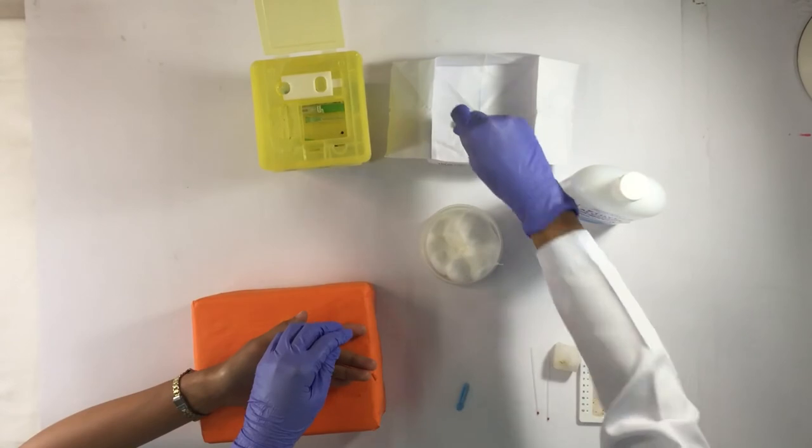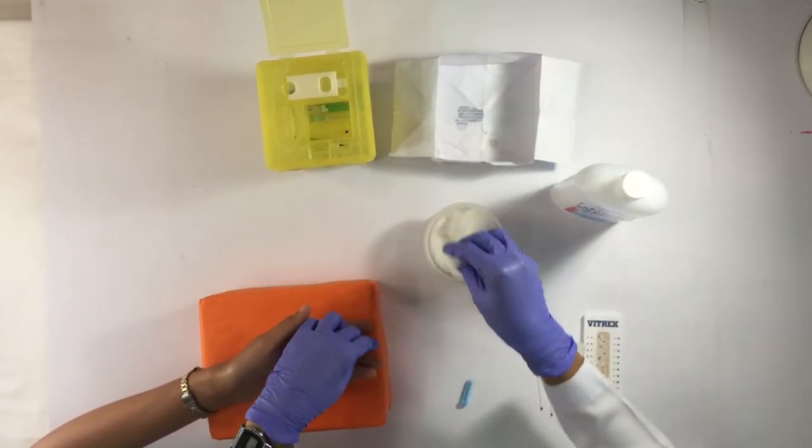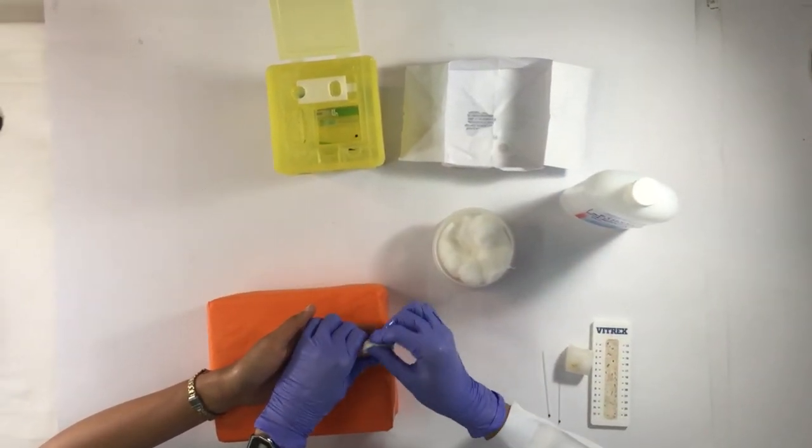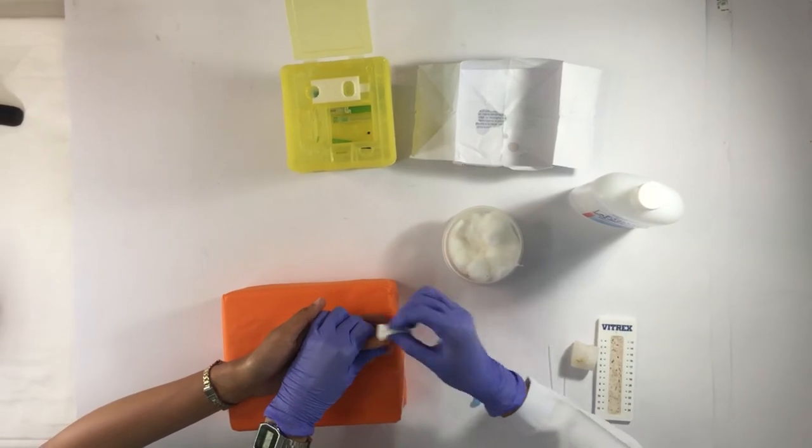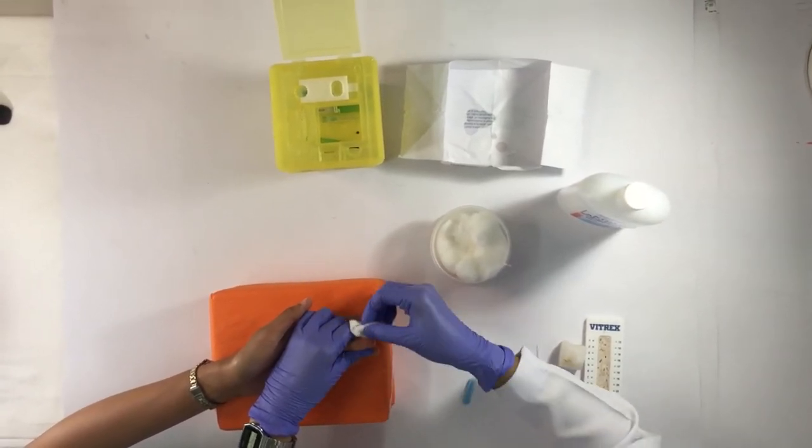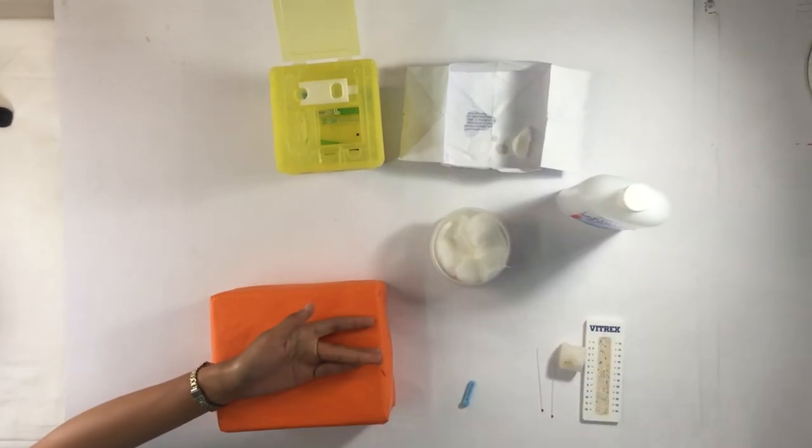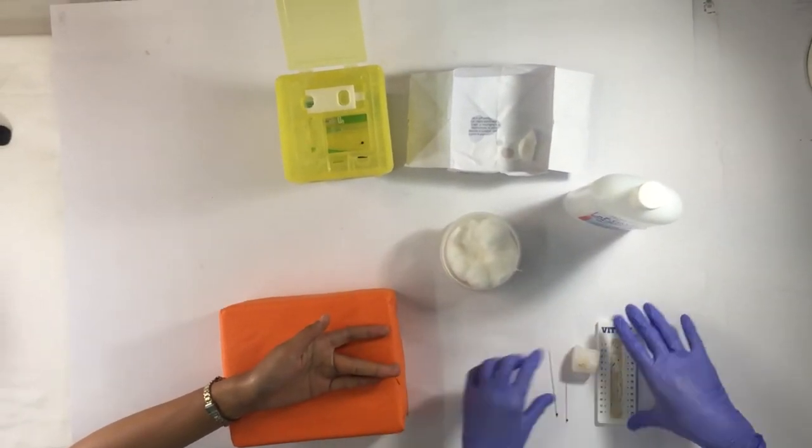Disinfect the site using cotton wet with alcohol. Remove excess alcohol from the cotton as much as possible. The manner of disinfecting the site must be in a circular fashion. Wait for the area to dry properly.